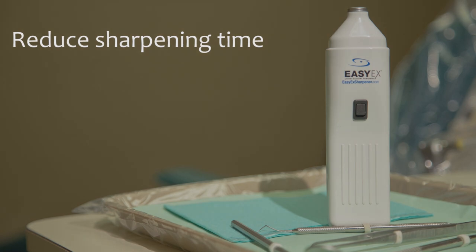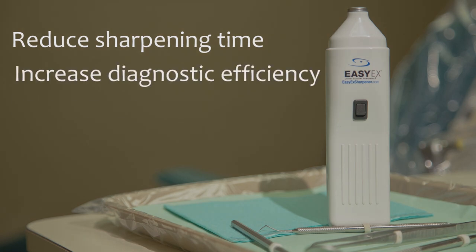With the EZX, you can keep your explorer sharp without the hassle of conventional sharpening methods. The EZX will reduce sharpening time, increase diagnostic efficiency, and save money.